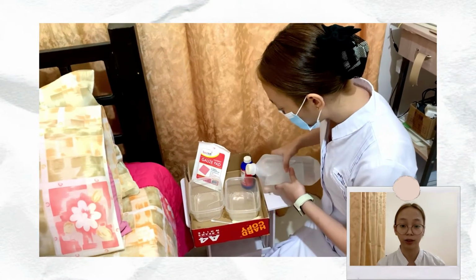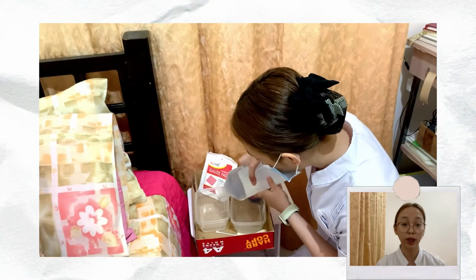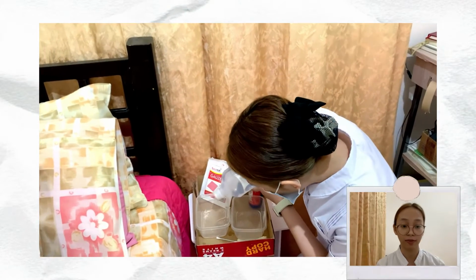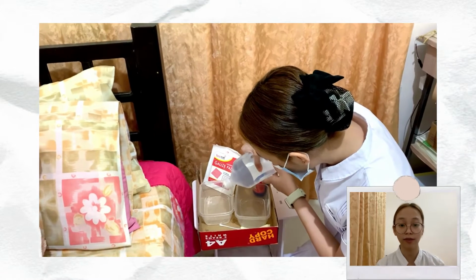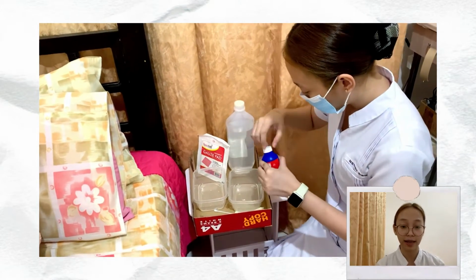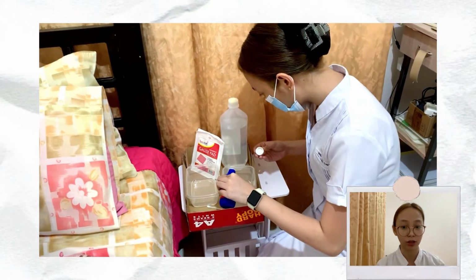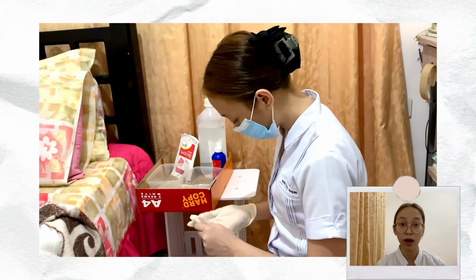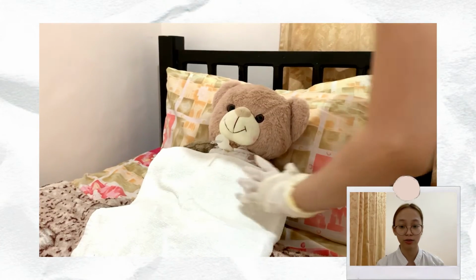Mix sterile water or plain NSS and H2O2 in one basin 50-50. Be sure it will fill 0.5 inch of the basin. Add another plain NSS in another basin that will fill at least half inch. Number 12, perform gloving. Cleaning the tracheostomy.